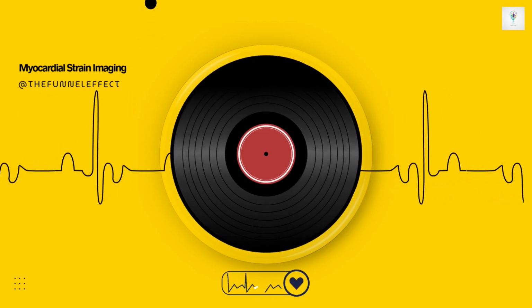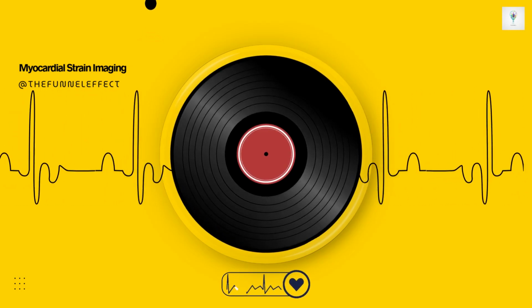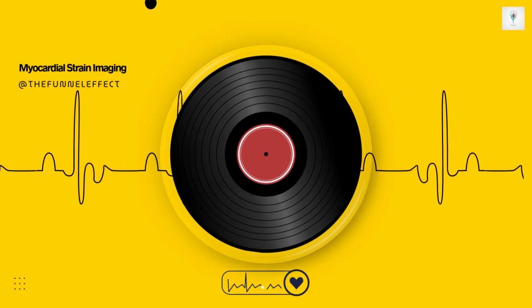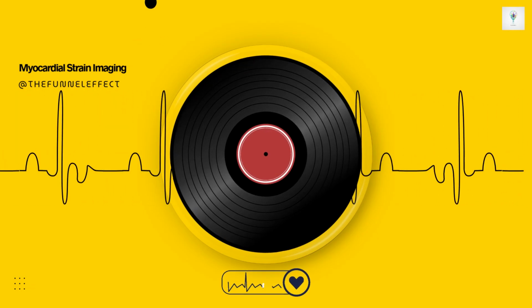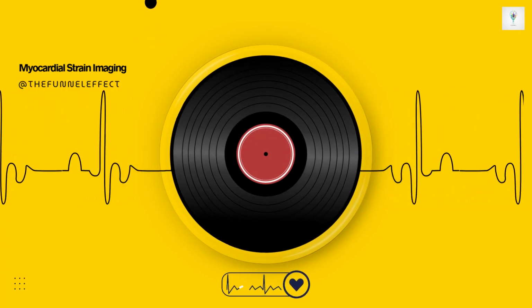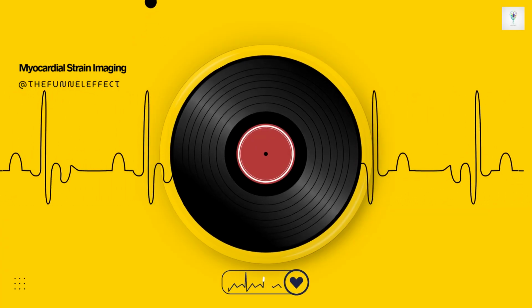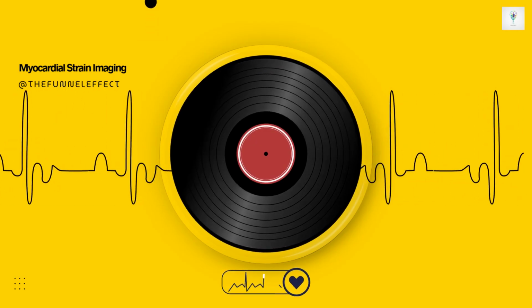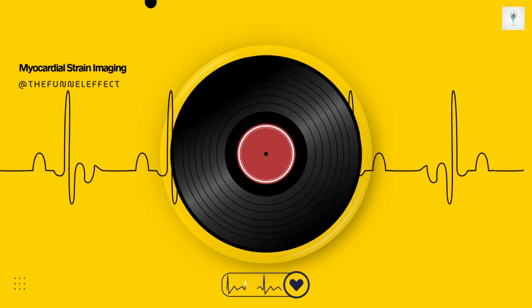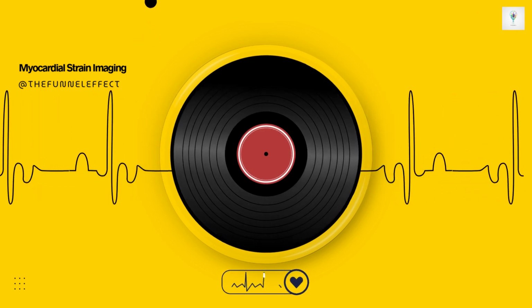But the heart's motion is more complex, isn't it? It's a twisting motion. Yes, absolutely. That brings us to the three shear strains. These describe the more complex 3D aspects, the twisting and sliding of myocardial layers relative to each other. Are these used as much clinically? They're less commonly reported day to day, but they are important physiologically.